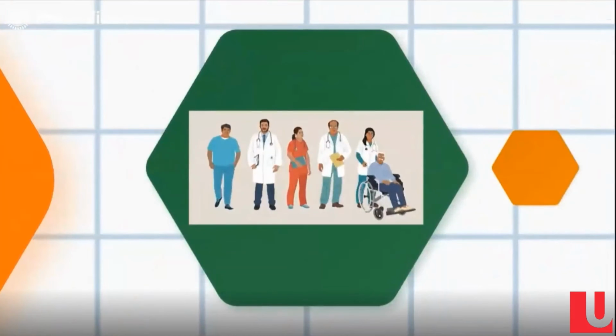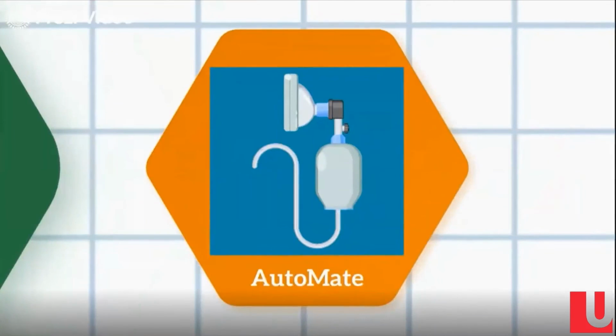We learned from our stakeholders, doctors in Gujarat, India, that in such scenarios, the patient is manually ventilated using a BVM by ambulance personnel. These medical personnel can often be understaffed and overworked. Pumping a BVM for journeys of up to an hour pulls them away from other aspects of critical patient care and can increase human error. Automating this manual process would alleviate medical personnel of this work. We present to you a low-cost, lightweight, and robust automatic BVM, a solution that we hope and believe could be modified and scaled for the global community.